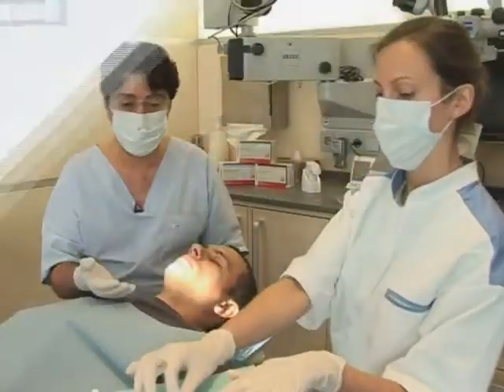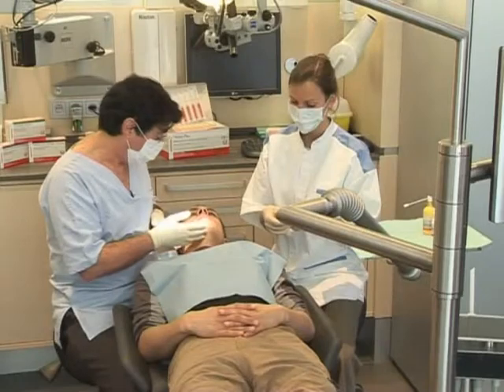Once the patient is in the chair, they are placed in the reclining position.